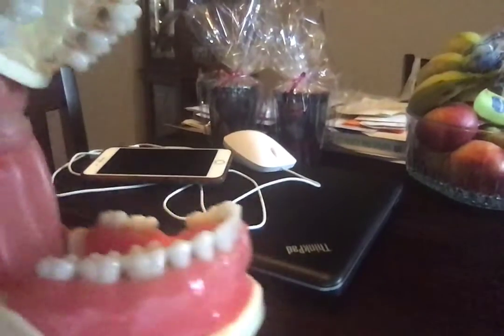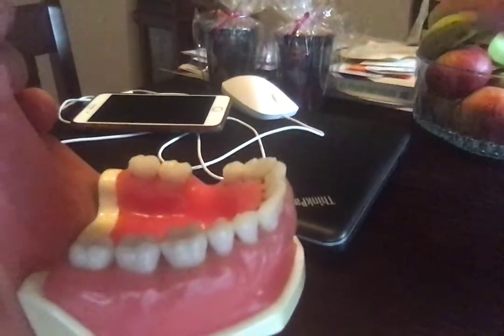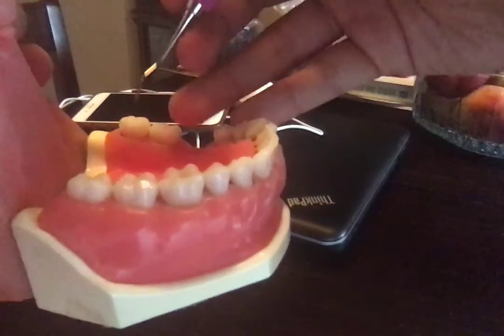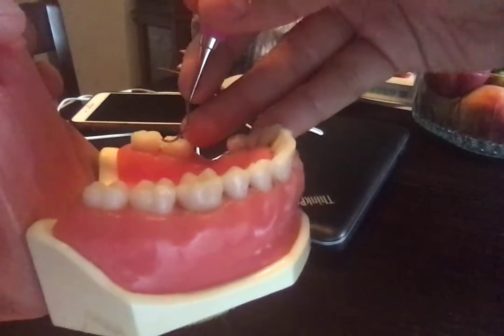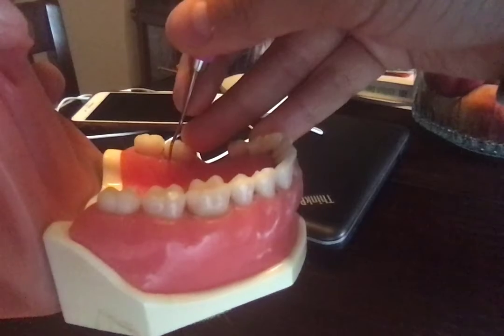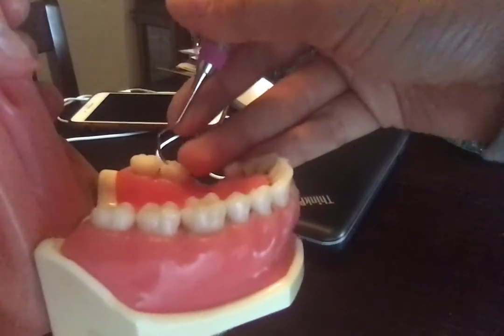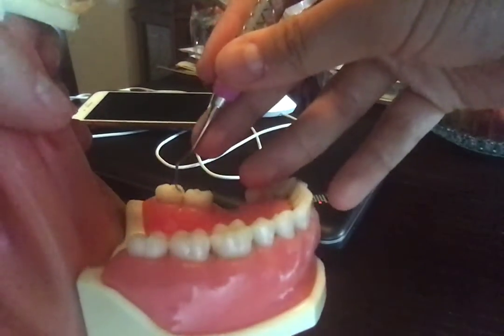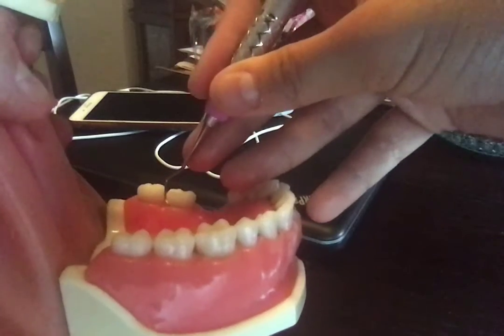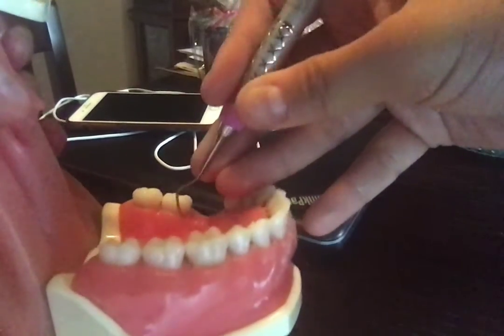Now let's do the lingual for this. You would still do the same — check the right working end; that's good because it's V to the D. You would insert, closed, open, and then rock. Do the same — it's a little hard here because we're missing a tooth, that's where I would fulcrum. But you insert, closed, open, and you rock and roll.